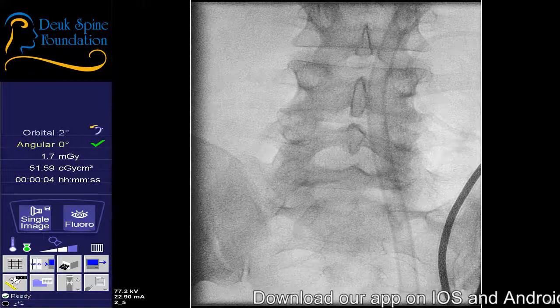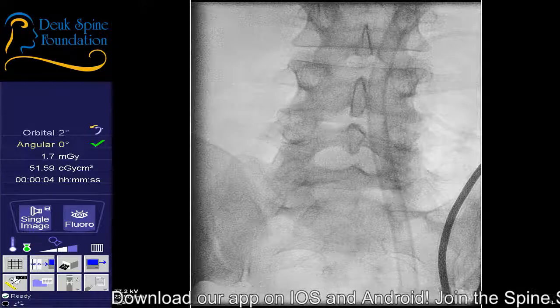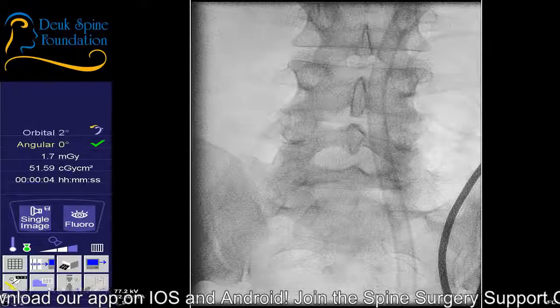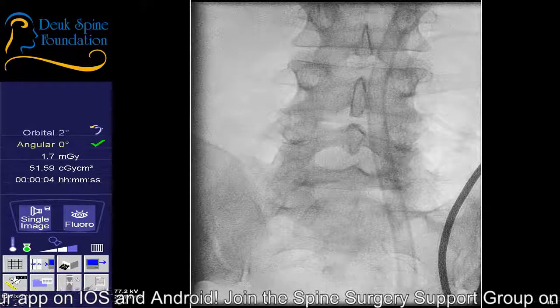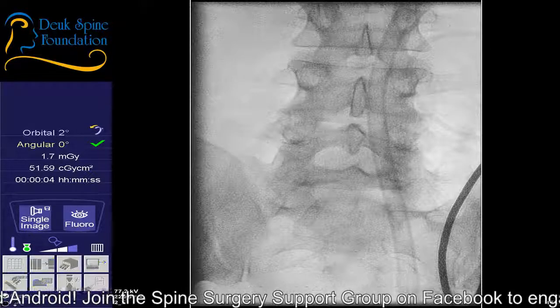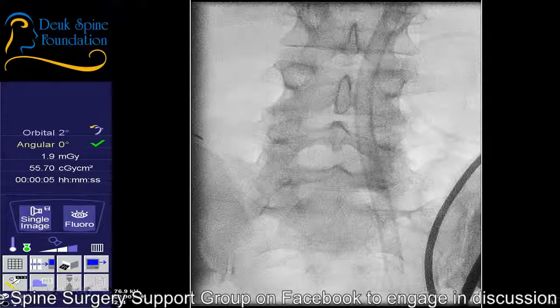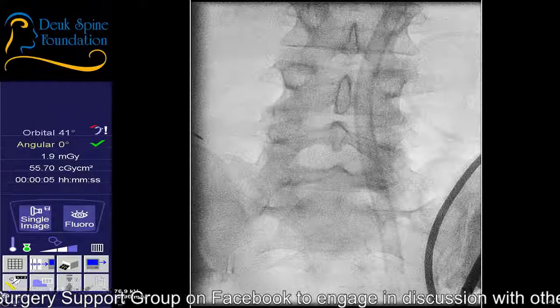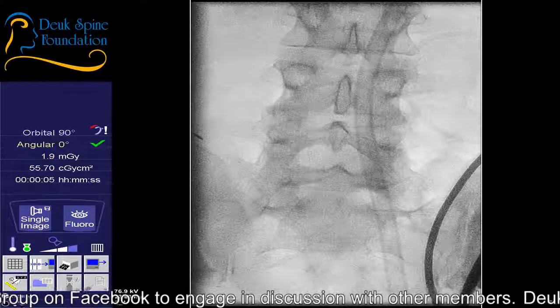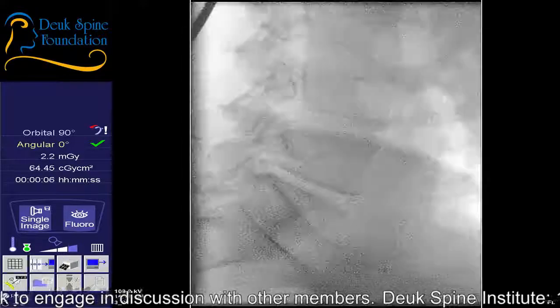I always have to have one of these here, so you need to put one back here, okay? Always. Throughout the surgery. That's just me palpating around, okay? Shot. Lateral. Let me know when you're good. Yeah. I think it's more than that, to be honest with you. I think you need to give him something to relax a little bit. I would talk to Dr. Santiago and ask him.